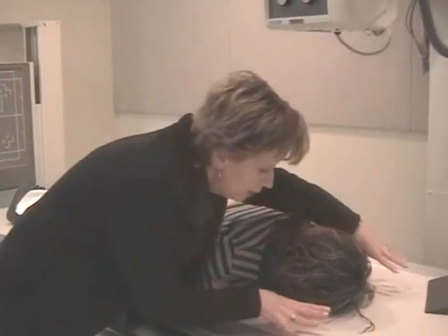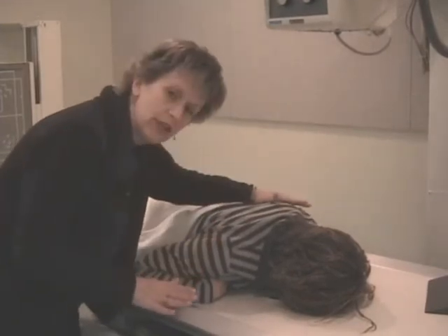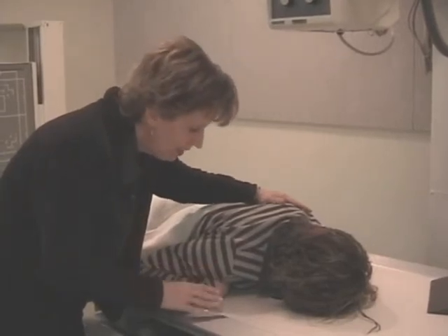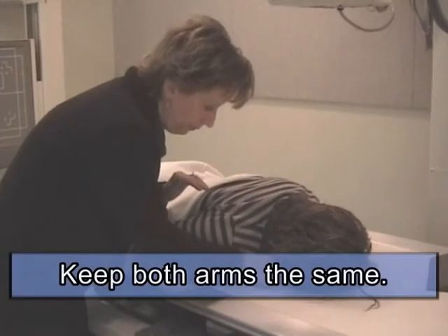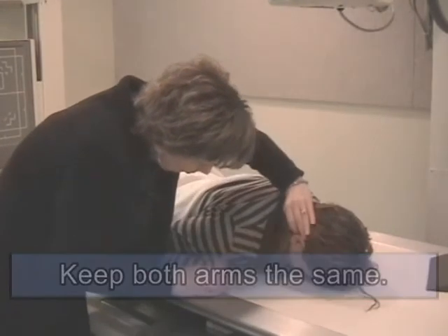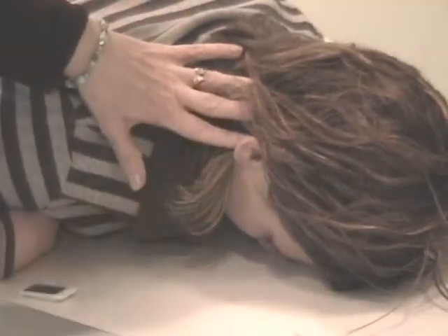Sometimes it's better to have the patient's arms up by the skull, sometimes underneath the chest or off to the side. Breast tissue on women can affect the pain level. So pay attention to the needs of your patient and you might readjust their arms. Whatever you do with one arm, you do with the other arm. Okay? So again, I'll hold her hair up and I think you can see the orbital meatal line is perpendicular. Make sure you get off to the side, not like I was with the camera for demonstration, but actually physically you be in alignment with that line.